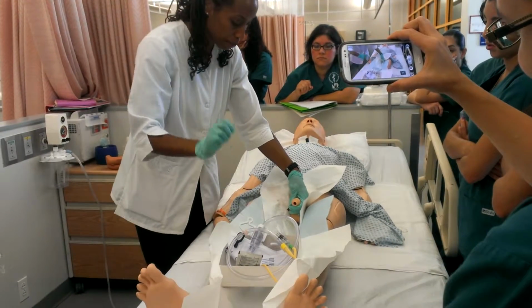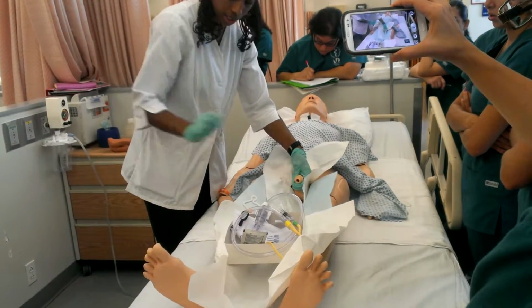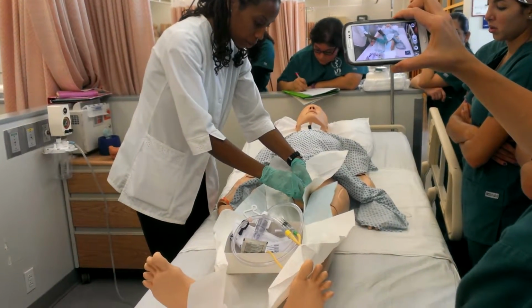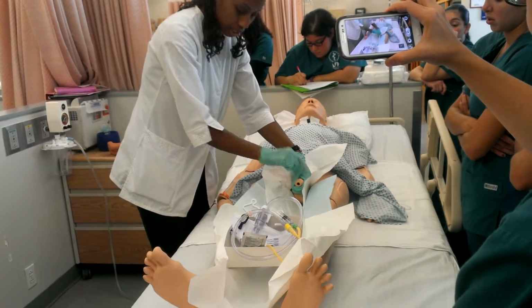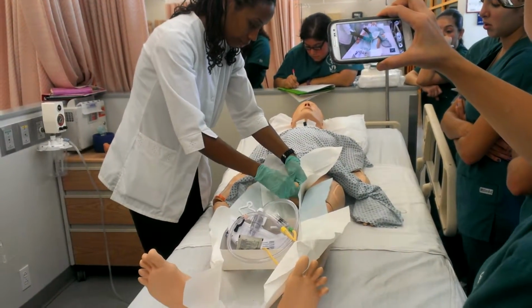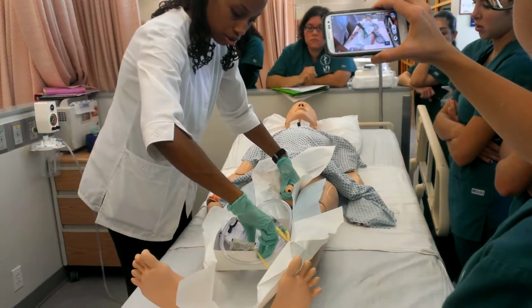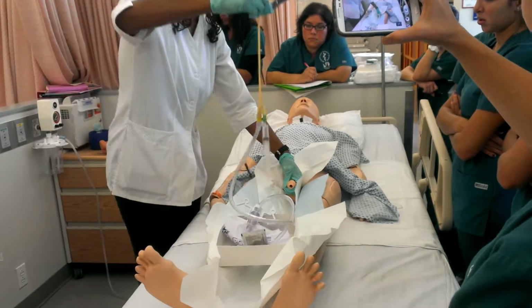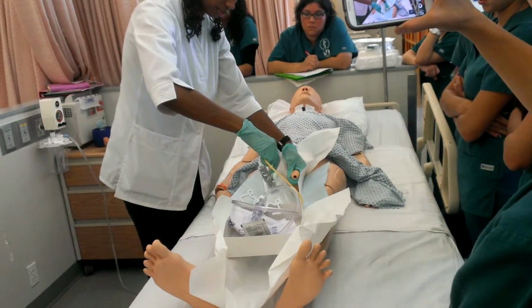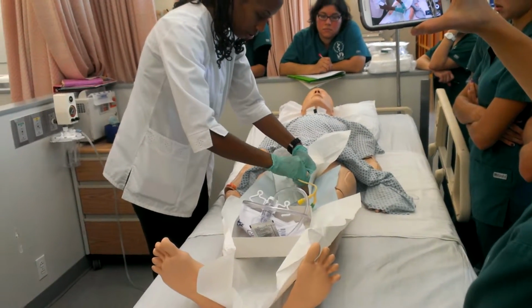You take your first swab stick. You go from the meatal opening back to where your hand is. You toss. Second swab stick, again, you go from the meatal opening back to where your hand is. Toss. Third one, meatal opening back to where your hand is, and you toss. And then all you do is you just take your Foley. And then you just go in.